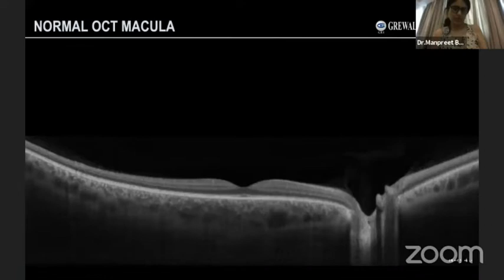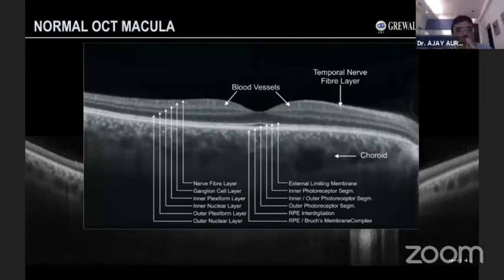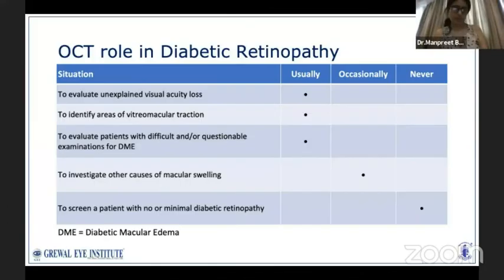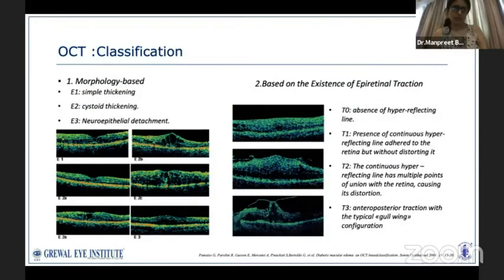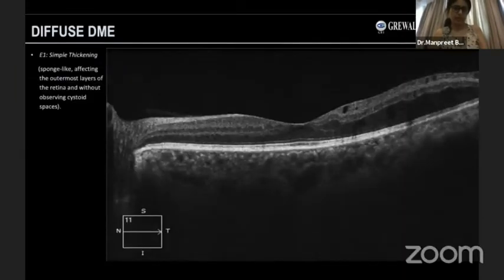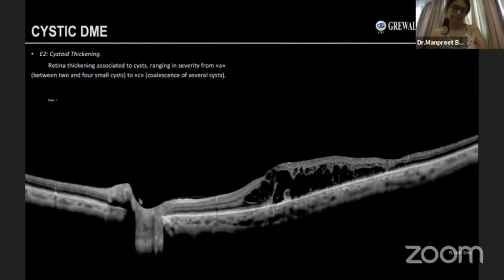Moving on to OCT — optical coherence tomography — the most widely and commonly used diagnostic imaging modality today. The common indications of OCT use in diabetic macular edema are important to discuss. A traditional classification of diabetic macular edema on OCT is based on morphology. In clinical practice, common patterns include diffuse diabetic macular edema with enlarged hyporeflective spaces, and the cystic type with large hyporeflective oval intraretinal cystic fluid spaces in the outer plexiform, outer nuclear layer, and sometimes tiny ones in the inner nuclear layer.